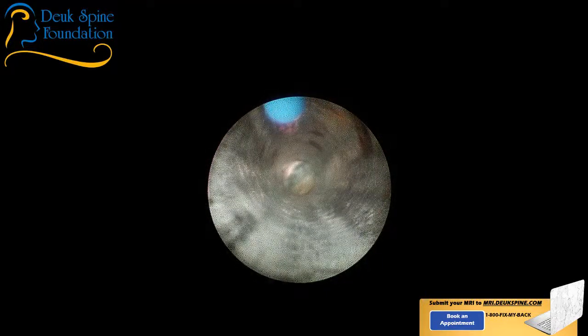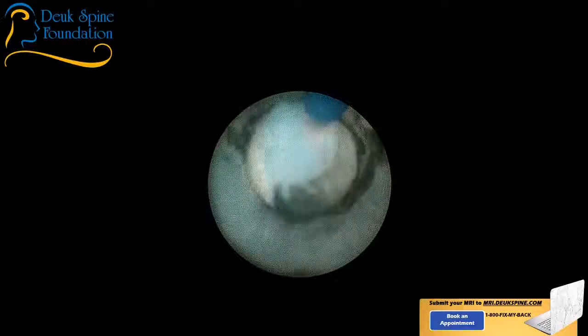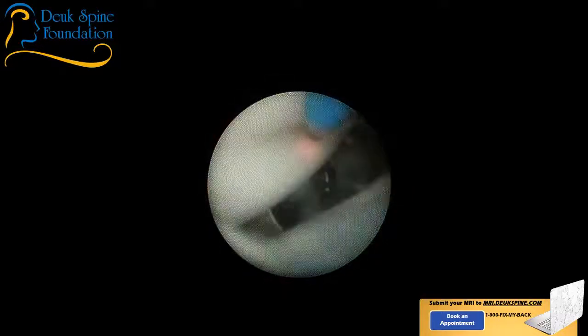Okay, careful, don't let those cables go down to the side. Yeah, that's the non-sterile area. Oh, that's a big herniation right there. Look at that. Floating out.